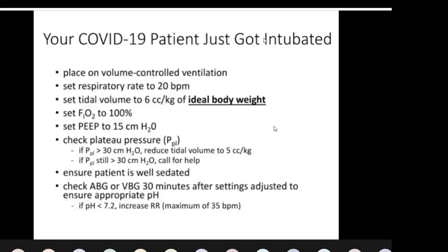Once the patient is on ventilator, the two things that would hinder the ventilation would be high plateau pressure, which would make the patient restless, distressed. So the next thing would be to look for the plateau pressure. And if the plateau pressure is high, I would decrease the tidal volume some more. And if still the plateau pressure doesn't fall, he has to be evaluated likewise.